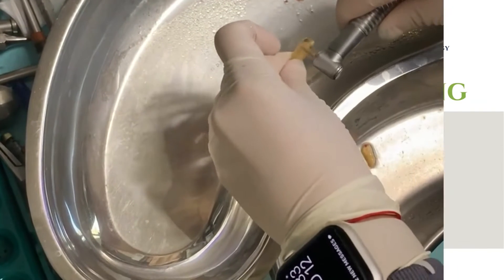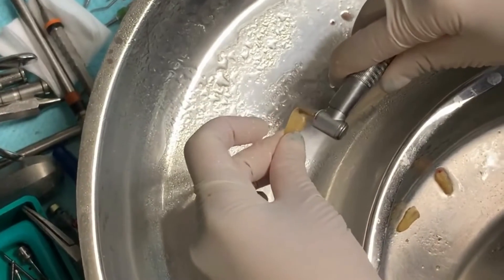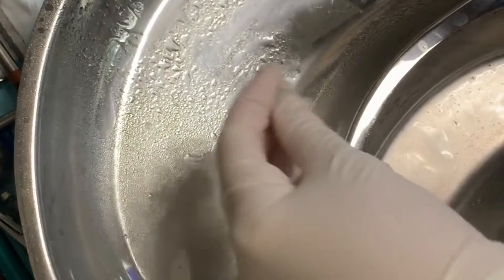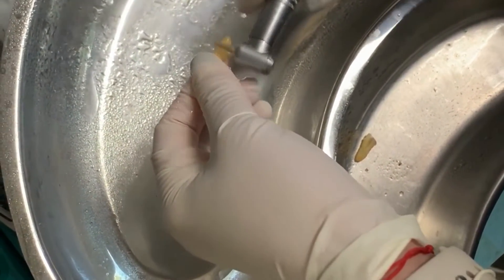We're taking the soft tissue out of the teeth that were extracted. We are going to grind them and this will be bone for bone grafting.